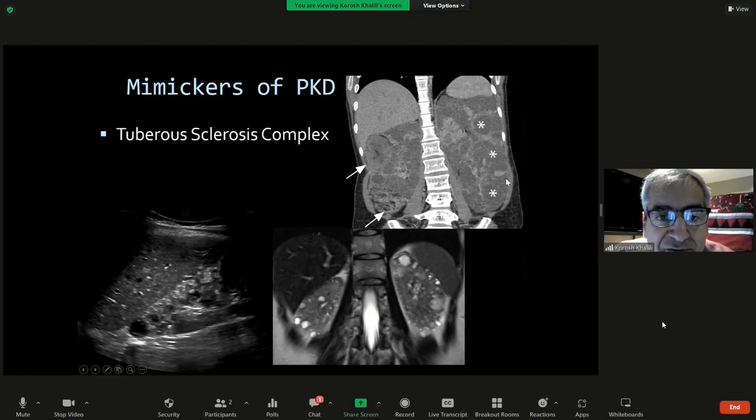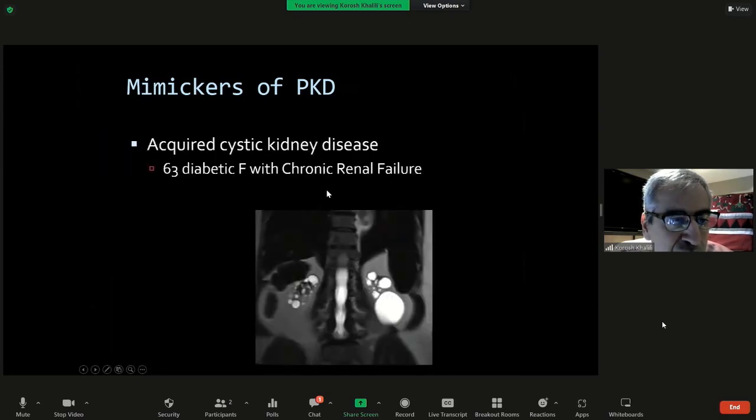Sometimes the cystic disease is really prominent. And so like in this patient, the kidney on the left side is massively enlarged. It's pretty large on the right too, but not as bad as the left. And these asterisks are on cysts in the kidneys. Also, these are the angiomyolipomas, and these we can easily identify because they have fat in them. So fat is easily seen on CT and MR, so we identify them as angiomyolipomas, and so tuberous sclerosis complex. So those are patients with genetic diseases.